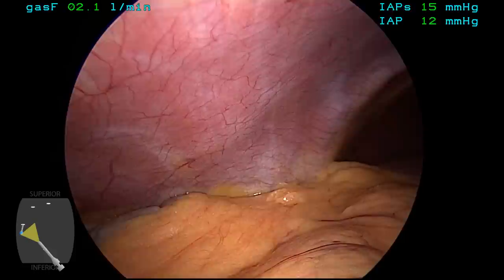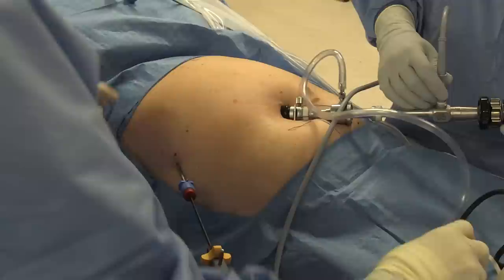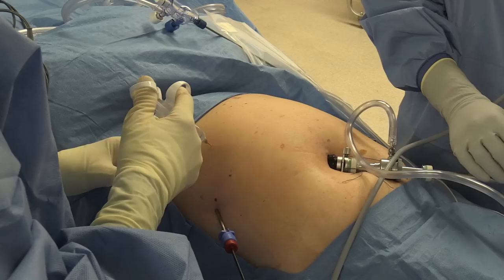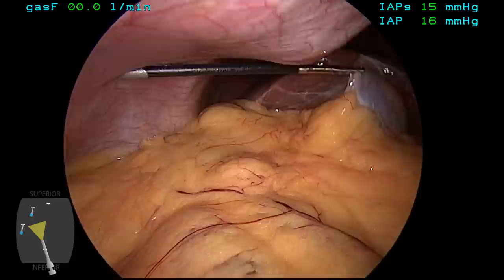Local anesthesia with bupivacaine 0.25% is injected, a small stab incision is made, and then a 3-millimeter port is placed in the lateral right subcostal position under direct visualization. One can now see the gallbladder which is grasped and elevated, and I like to do this first because it allows me to more precisely place the mid-clavicular port which will be used for retraction of the neck of the gallbladder. Again, local is infiltrated and a small incision is made, and then the 3-millimeter port is placed under direct vision.